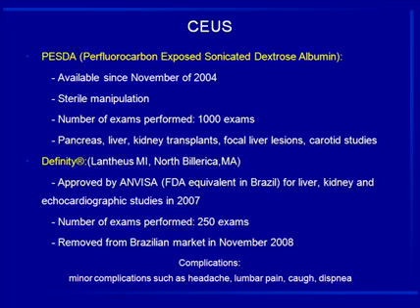We performed almost 250 exams, but it was removed from the Brazilian market in November of 2008. The complications are minor complications such as headache, lumbar pain, cough, and dyspnea.